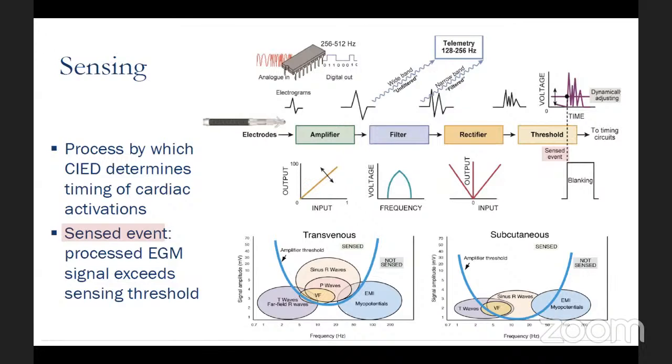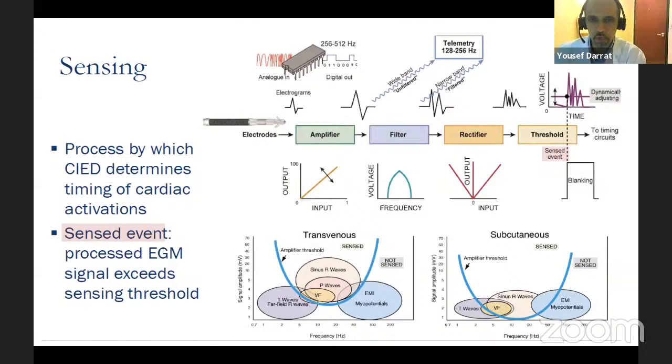And are you worried about artifact, or about lead tip heating? For cardiac MRI, you're worried about artifact. An abandoned lead is an abandoned lead, whether it's 2 or 3, or maybe higher risk with more. And heating, like we said, Dr. Wael Busnena mentioned that that's not a huge concern anymore.